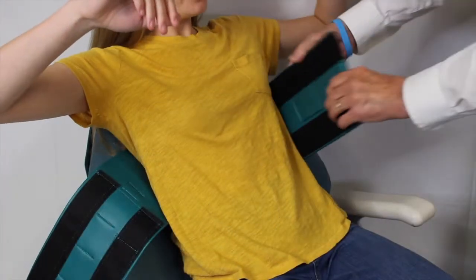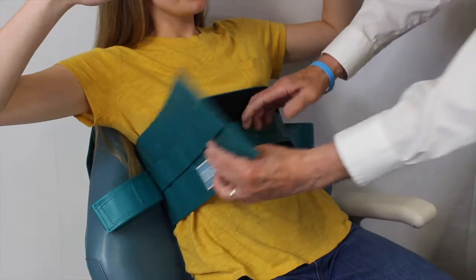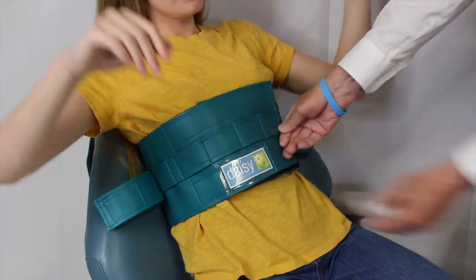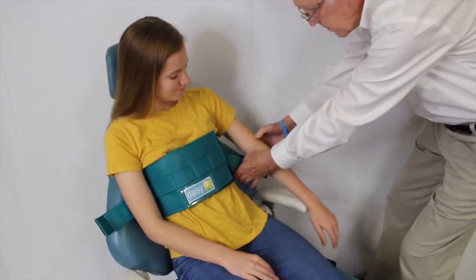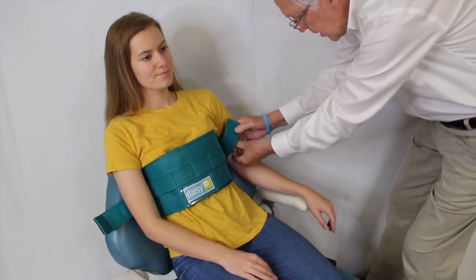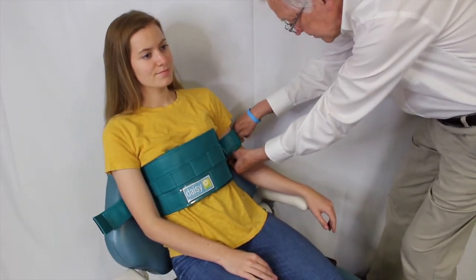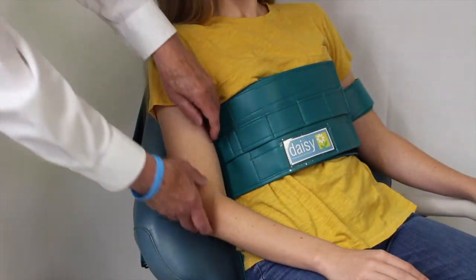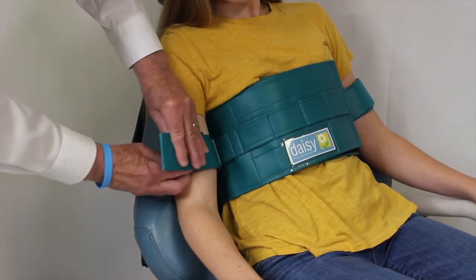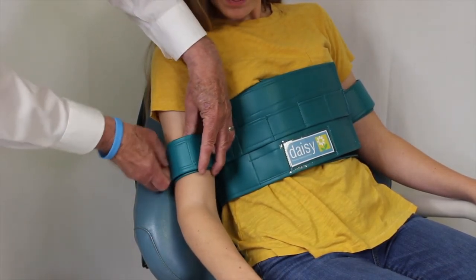Chest wrap. Open the chest wrap and position it around the patient's chest. Wrap firmly around the patient's chest and attach to the Velcro on the wrap. Side arm wraps. Position the patient's upper arm in the side arm wrap and close using the Velcro on the wrap. Position the patient's other arm in the side arm wrap and close using the Velcro on the wrap. This will secure the patient in the chest and side arm wraps.